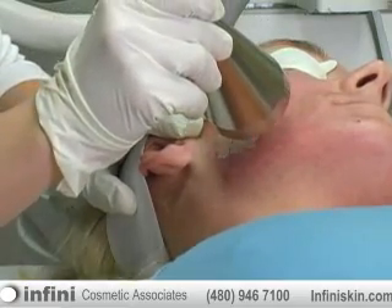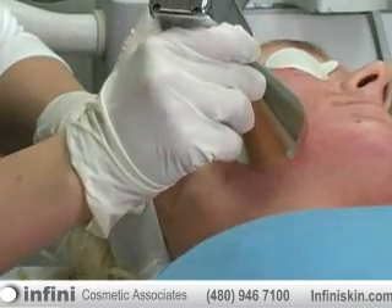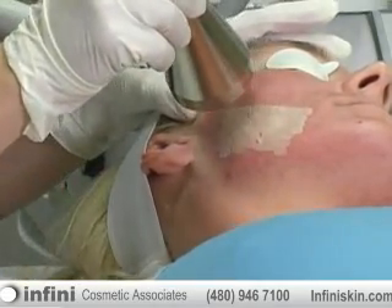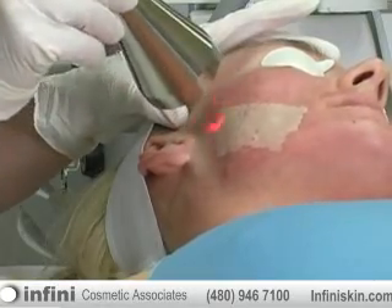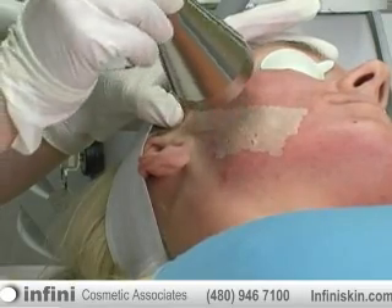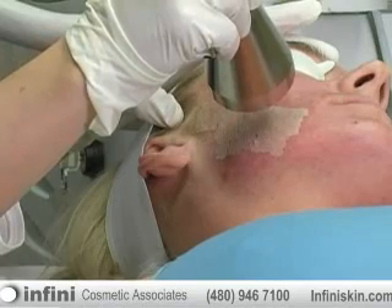Just to give people an idea of the depth that we're going when we're actually resurfacing the skin of this patient right here, we're only going about 10 to 15 micrometers deep in the skin. A typical microdermabrasion might only take off the top 3 to 4 micrometers of skin, so it's just kind of like a microdermabrasion on steroids, as I call it.